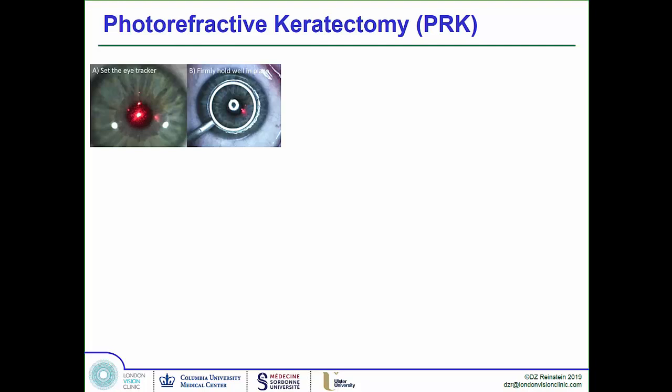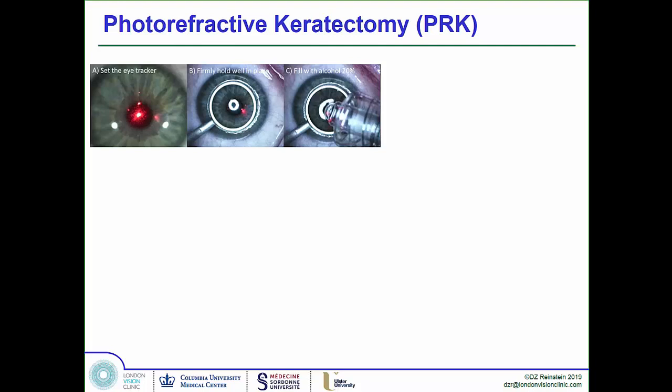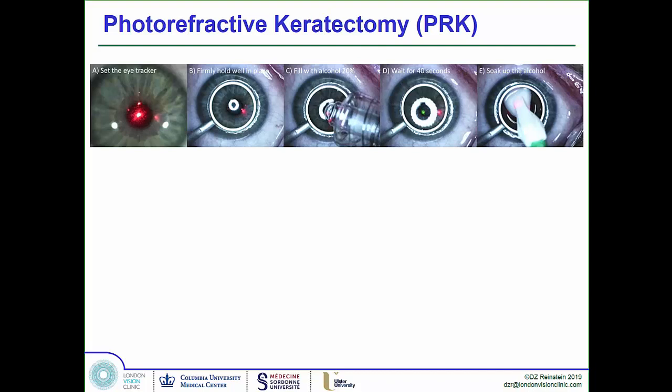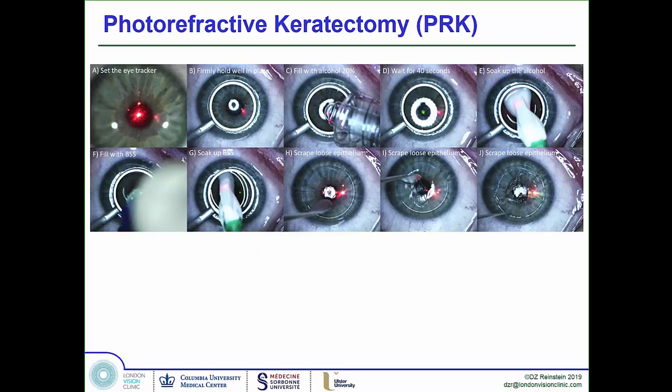You set the eye tracker, then place what we call a well onto the cornea, centered on the visual axis, and drip 20% alcohol into it. Alcohol dissolves hemidesmosomes, which connect the basement membrane to the stromal surface. You wait 40 seconds, soak it up, put some balanced salt solution in to wash out the excess, then soak out the BSS. You can then very gently use a blunt spatula to just push away the epithelium with no force at all.